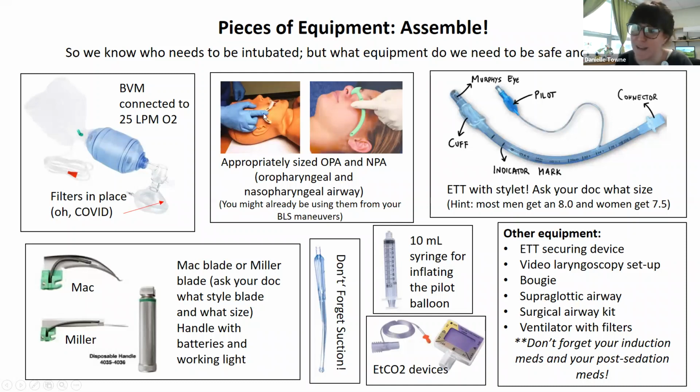But you don't want to use that on somebody that has a gag reflex still. So some of these patients, they might have a gag, but they're just failing to ventilate or they're failing to oxygenate. So when we talked about the 4 reasons to intubate before, people aren't going to have all 4 reasons. They might just have one of those reasons, and that's completely fine. Because they only have one of those reasons, it can make it a little bit tricky.